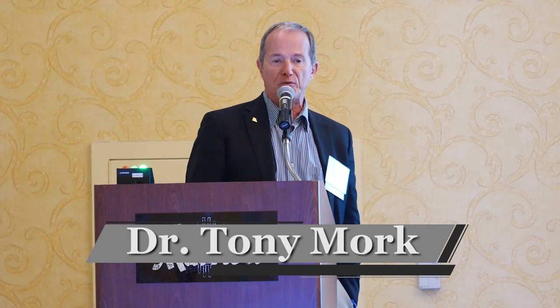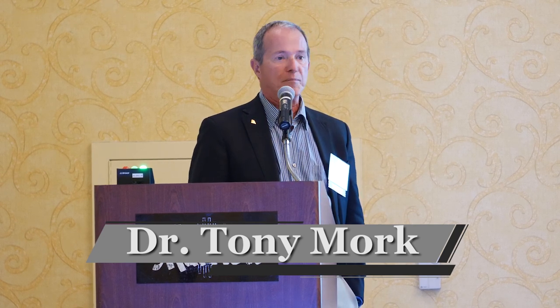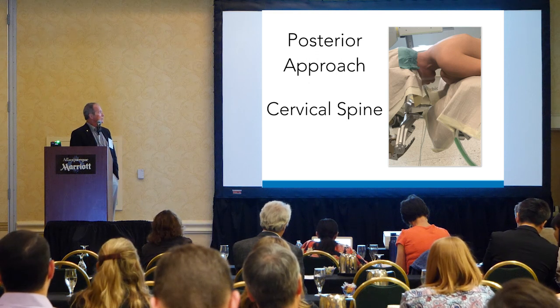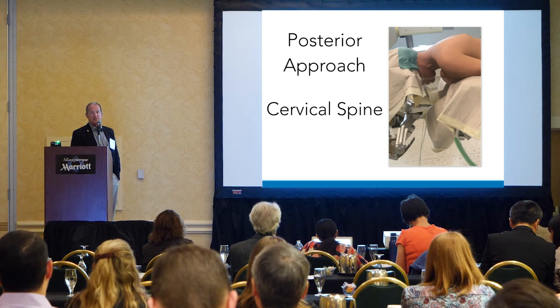Okay, so we'll just go through this. I'm going to start just with the basics and then we'll move right into it, and there are several short little video clips all along the way. This is a posterior approach to the cervical spine, which I think is really the best approach for the most utilitarian. This is a picture of the positioning in Germany.